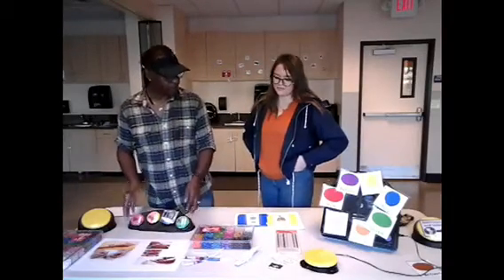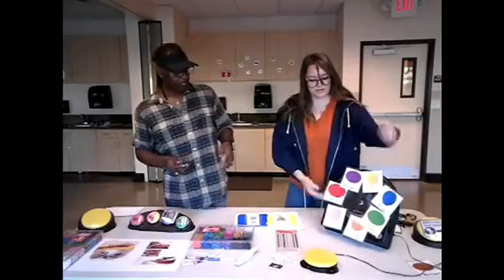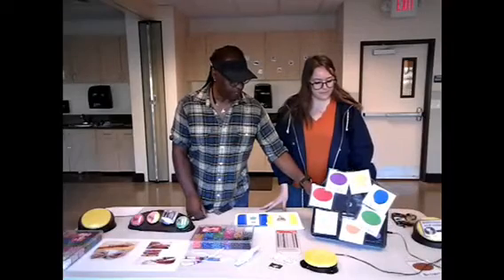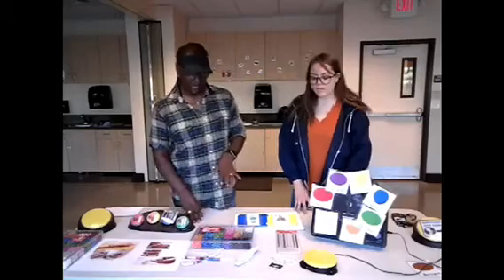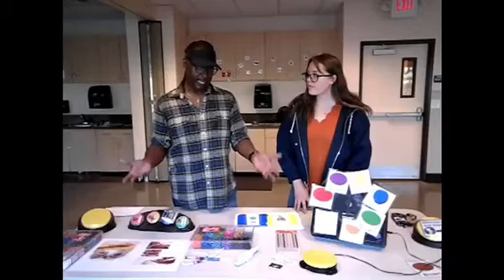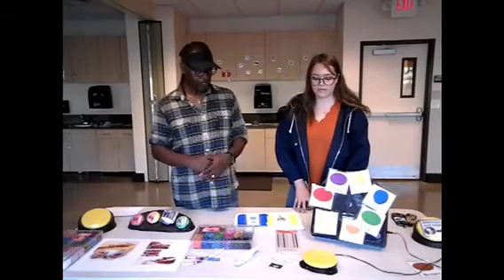What else do we have over here? We have our switch devices over here. This one, if we have an activity set up, is what we call a spin wheel, and we can place that in front of the consumers based on whatever the activity is. We have the bead set up here for the activity, but it could be any activity set up to utilize any switch to address the consumers.